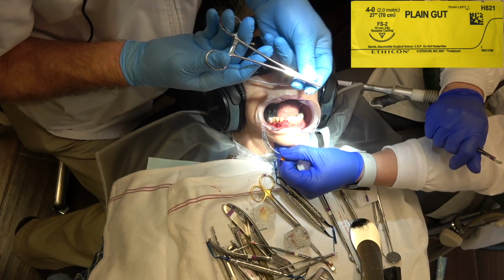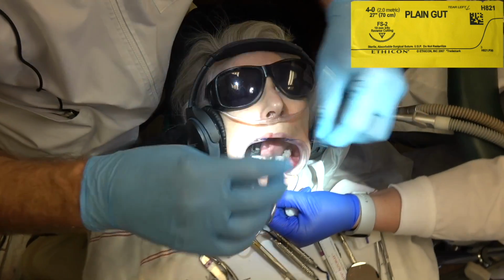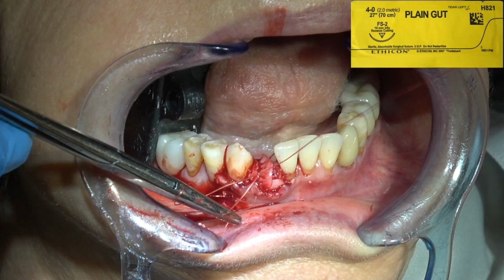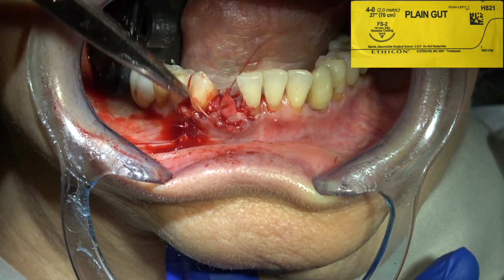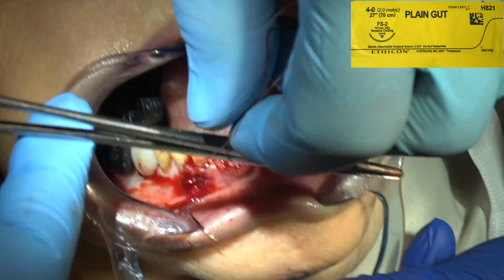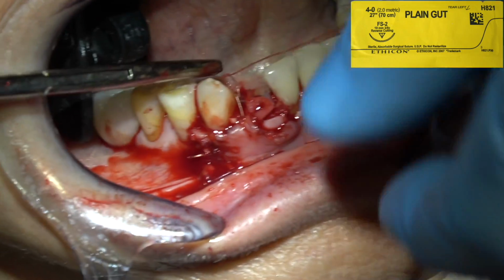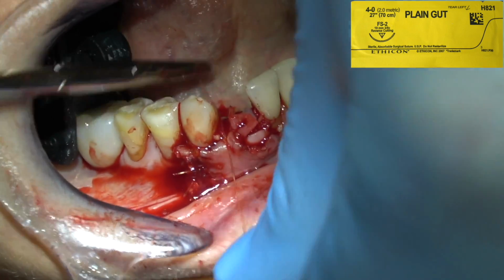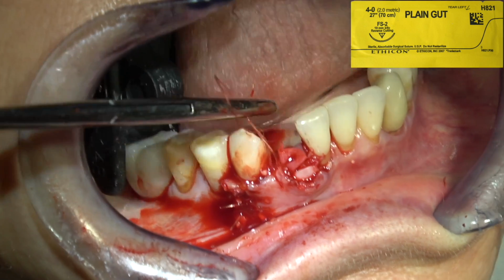So when I'm suturing, I'm going to go 1, 2, 3 wraps away and one toward me, then another one away, and I'm going to pull each one. So 1, 2, 3, pull, one toward me, pull, one away, pull. Now you can go just 1, 2 away and pull, and then one towards you and pull, and then one away and pull.